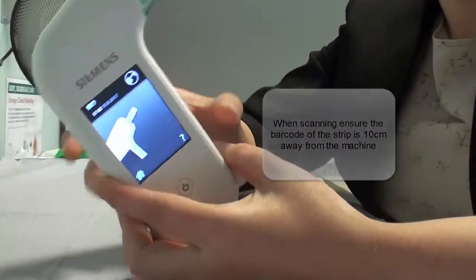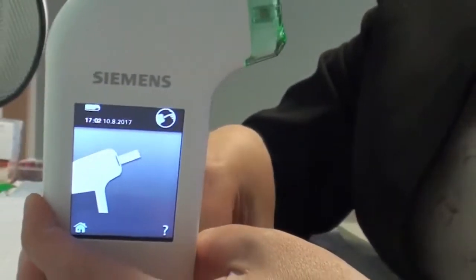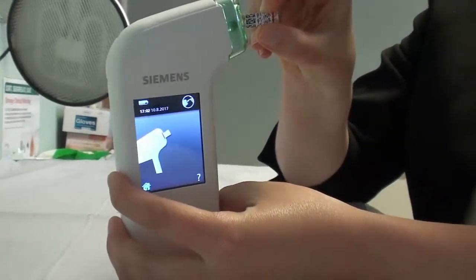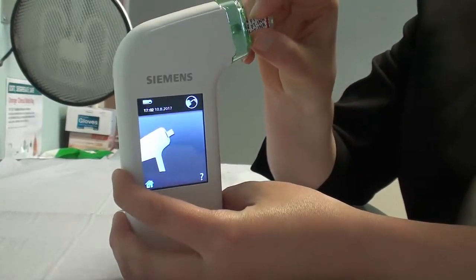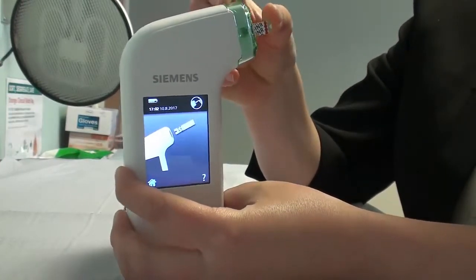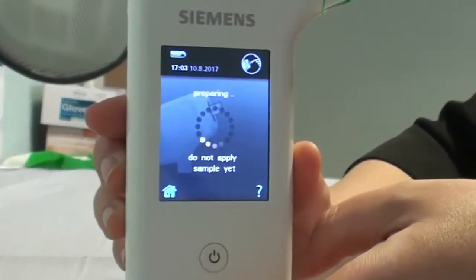The machine is then telling me to put the strip into the side of the machine. The two-pronged side goes in first and then we wait.